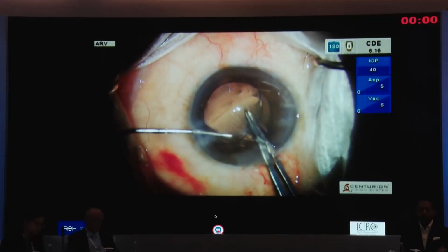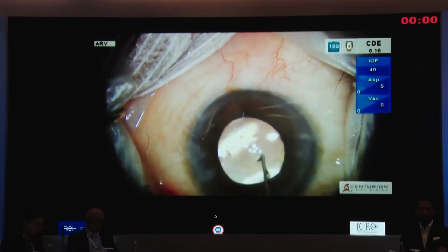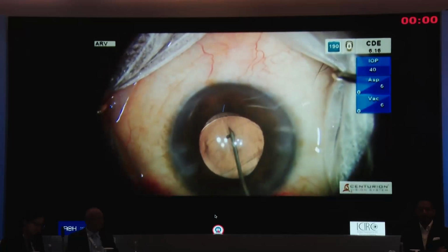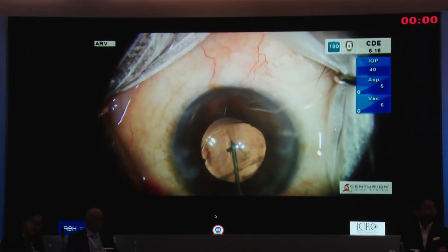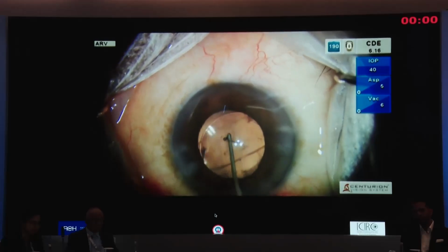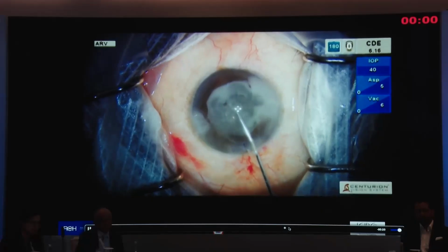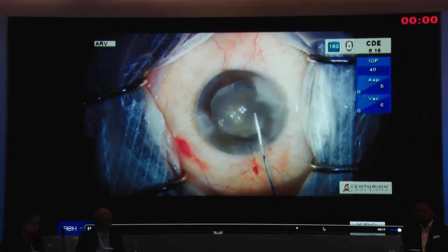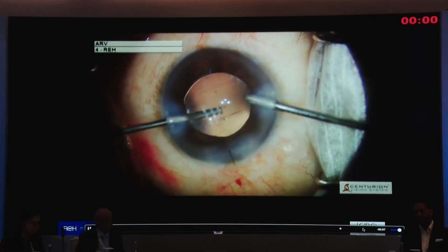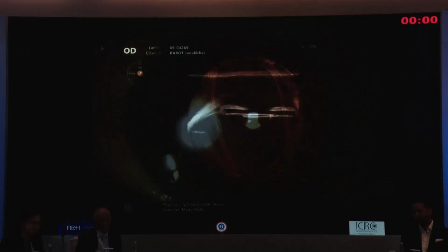And then I would like to capture this, and I have an option, anterior capsular rhexis, which is good with the lens, and also the posterior tear. This tear is very strong because it resisted all the maneuvers until the surgery. So I believe that the zonules are preventing it from going over to the other side of the posterior capsule. So I'm capturing through both the anterior capsule and that tear which is in the posterior capsule. Always make sure that there is no vitreous at the end. I had the vitrector out, so I had to use it and justify that. But otherwise, the IOL is captured through both the rhexes, and this is how it looked down the line.